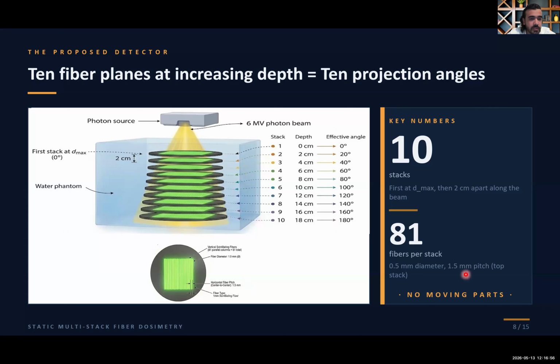And so this is the experiment. I'm using a 6 MV photon beam, and the fiber diameter is 1 mm. First of all, I'd like to add that for the reference I also used simulation. I didn't do any experimental work for the reference. What I did was score a thin water plane at the Dmax of the water.